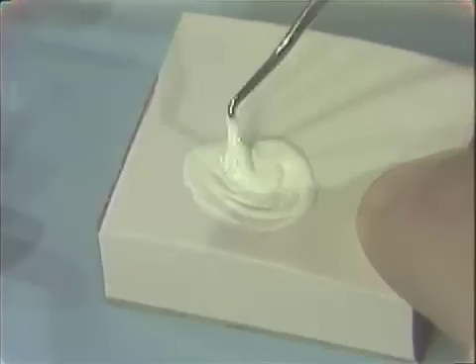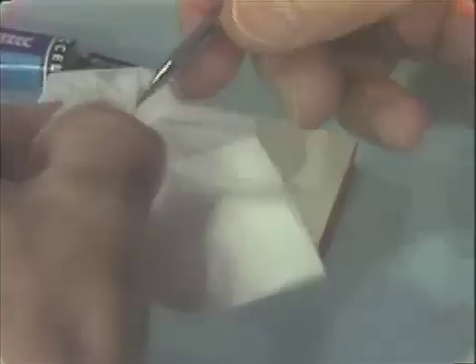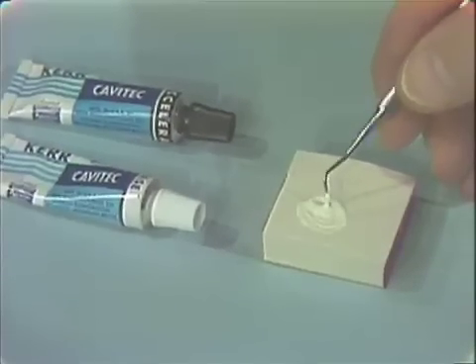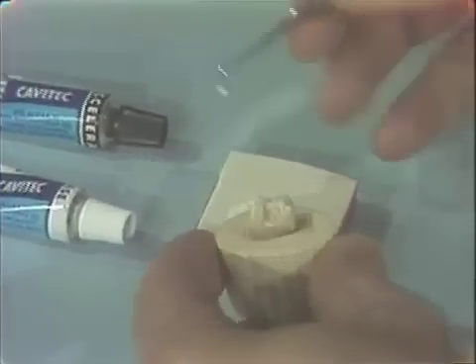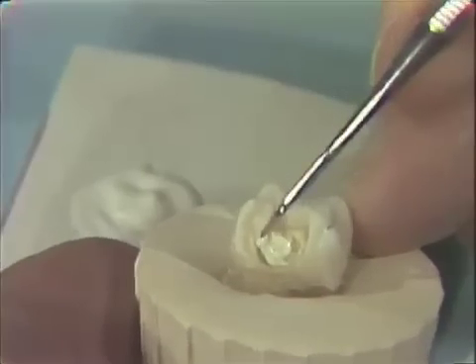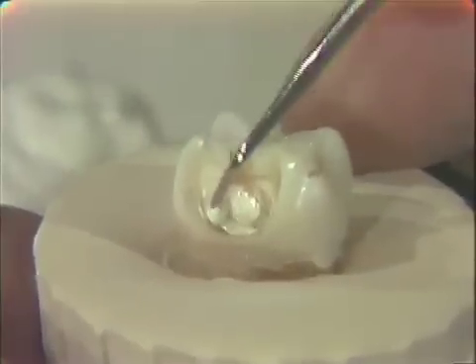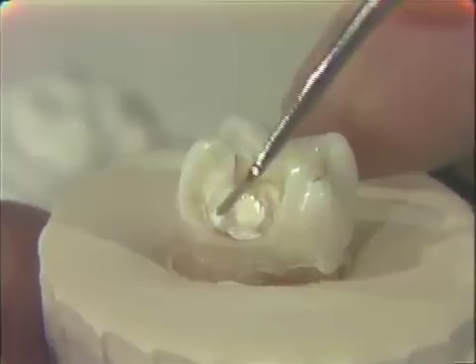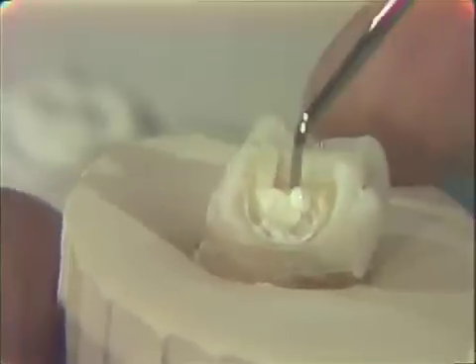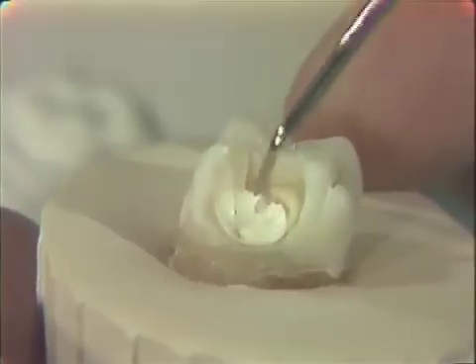When this is accomplished in a few seconds, the spoon excavator is wiped clean. A small portion is picked up and carried to the lateral aspects of the dentin wall to cover — in this case — the calcium hydroxide, or covering the full dentin area of a class C remaining cavity depth.